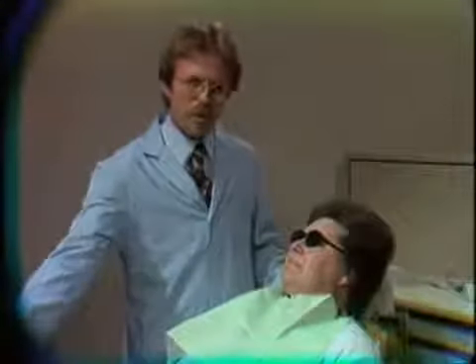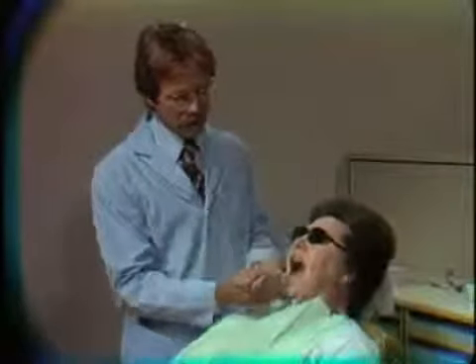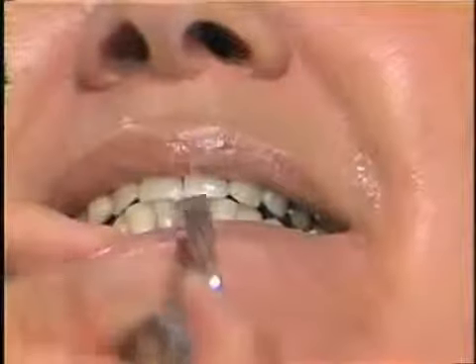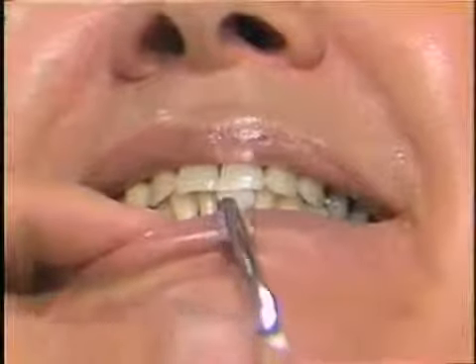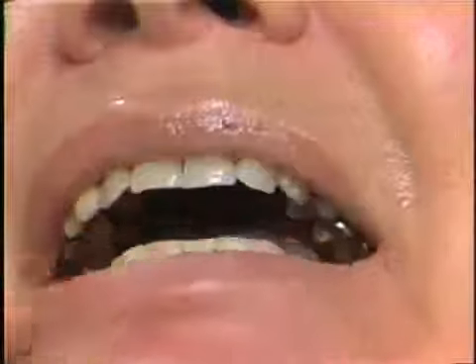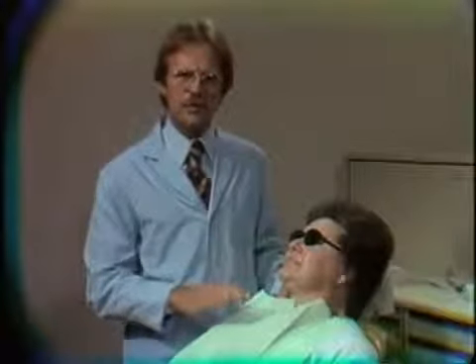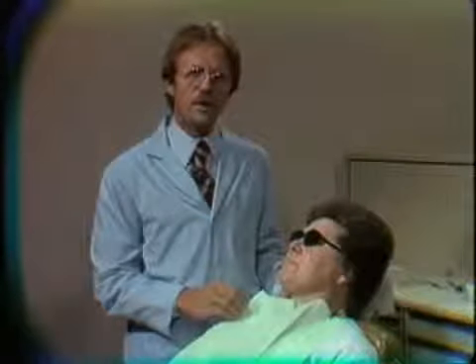Another thing we should absolutely be sure of, and not take the patient's word for, is to check with shim stock if the partial is interfering. Bite down. Open, bite on your back teeth. That's right. And we see that our anterior contacts, which we have previously noted that she has without the partial, she still has with the partial denture in position. Now the partial denture has been adjusted so it's out of occlusion and it's not interfering with any excursions that the patient is going to make.